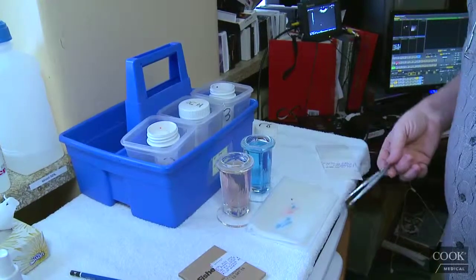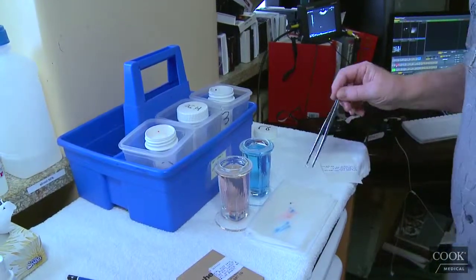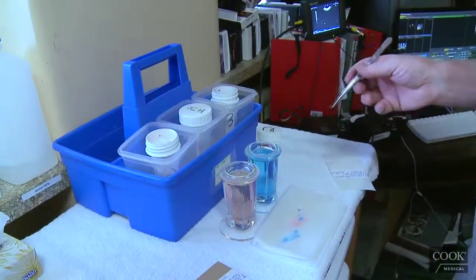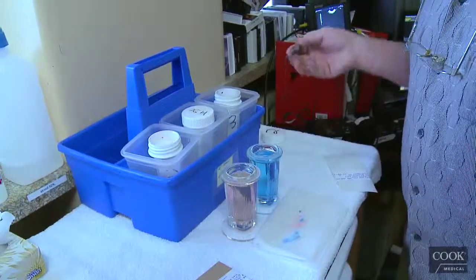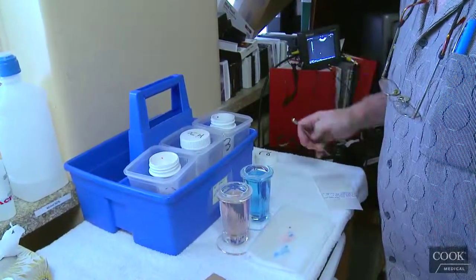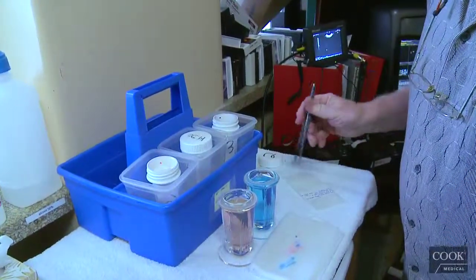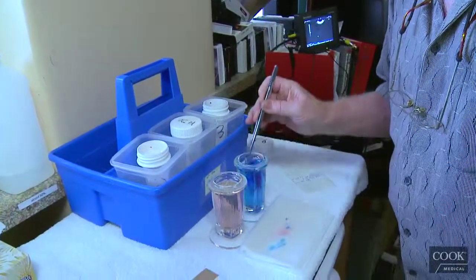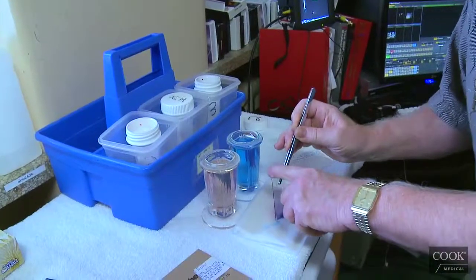Then when we're over with the staining, I'll go directly to the microscope without any cover slip on the slide. Usually it's enough to make a diagnosis. We don't need a cover slip, but if it's a more difficult case and we need the cover slip, I'll put it on.